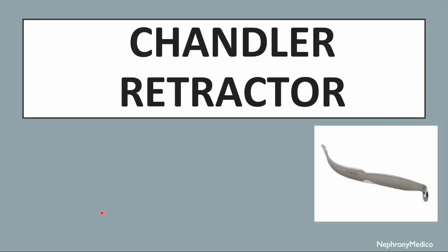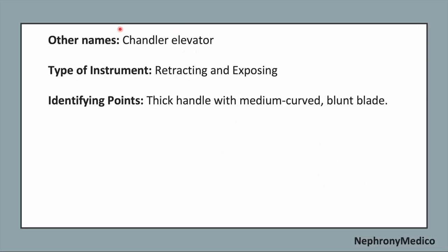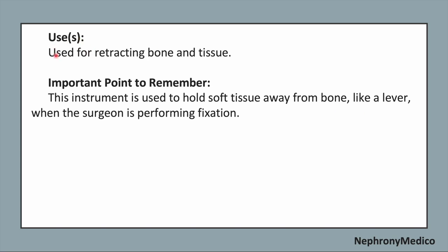Let's talk about Chandler retractor. This is a picture showing Chandler retractor. It is also known as Chandler elevator and it is a retracting and exposing type of instrument. The identifying points of this instrument are that it has a thick handle with a medium curved and blunt blade. Use: it is used for retracting bone and tissue. Important point to remember: this instrument is used to hold soft tissue away from the bone like a lever when the surgeon is performing fixation.